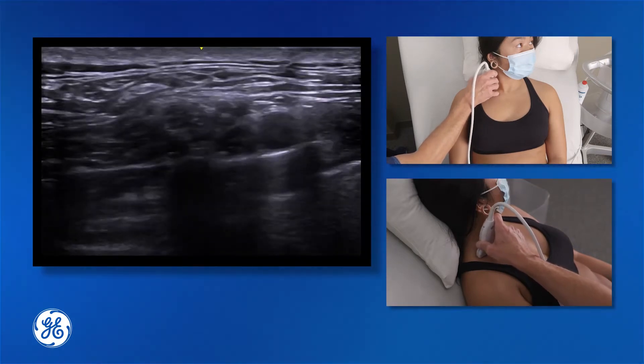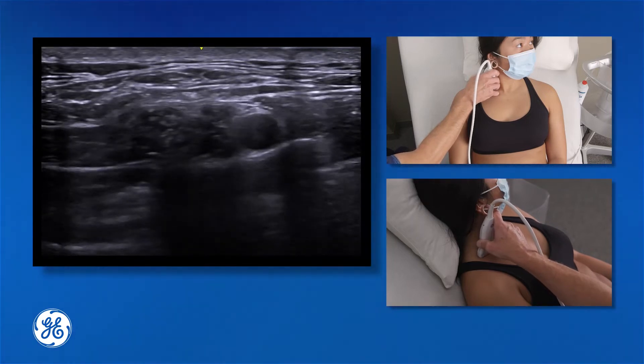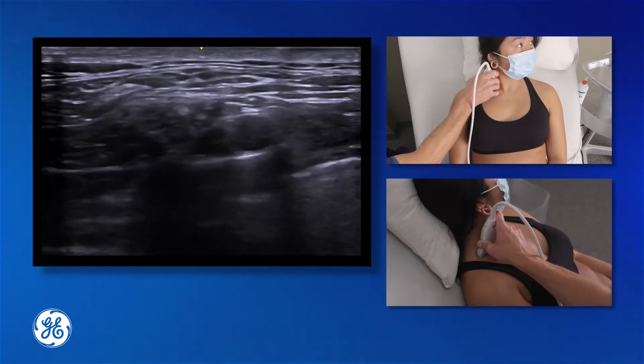If we angle the probe a little more cephalad, we can see the anterior suprascapular nerve running off below the omohyoid, and that's important to look for.